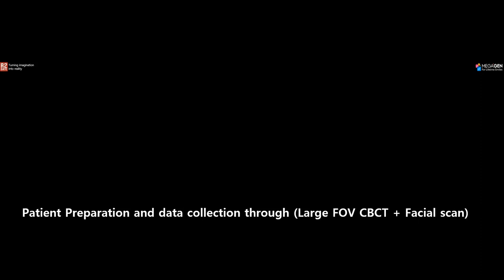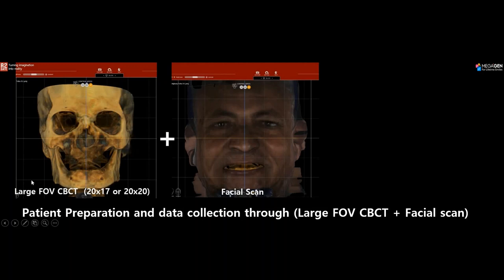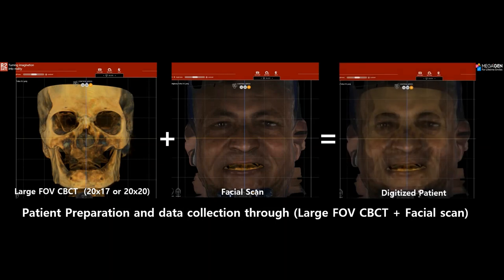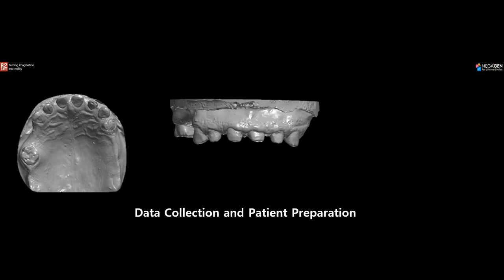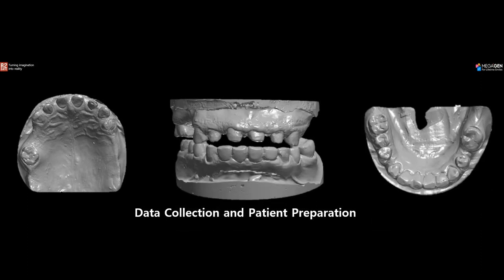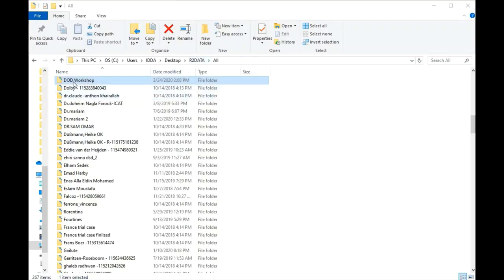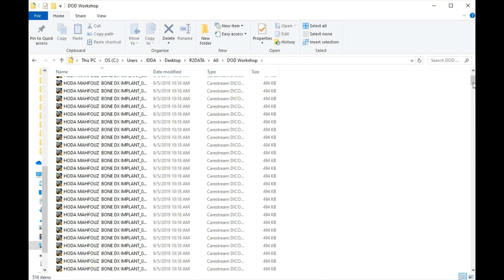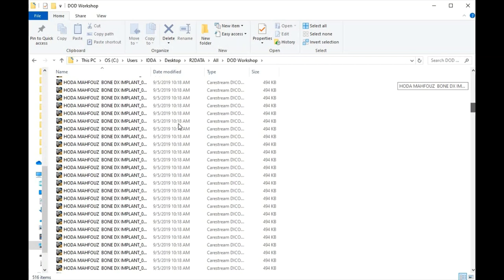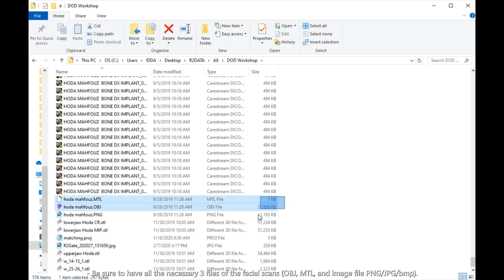First we'll start with Patient Preparation and Data Collection. To prepare the patient for Digital Oral Design, we acquire a large FOV CBCT — either 20x17 or 20x20 — then acquire a facial scan. We always get the upper and lower models of the patient, and we CBCT scan and intraoral scan the patient in centric relation. Inside the R2-Data folder, create a new folder named after the patient and place all files — the CBCT scan, facial scan, and models — in that folder.